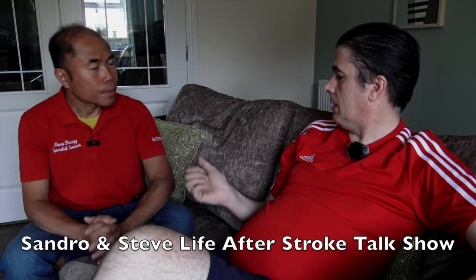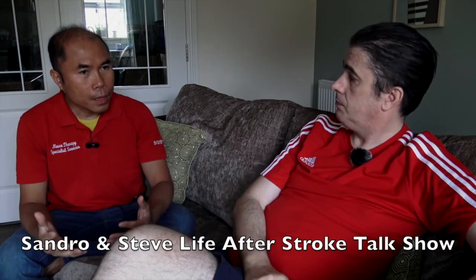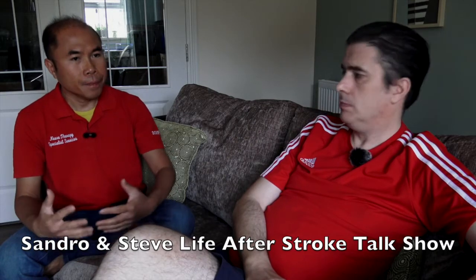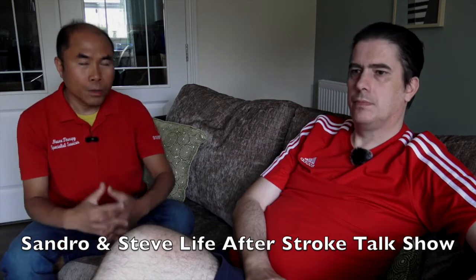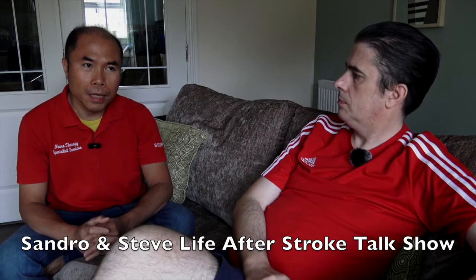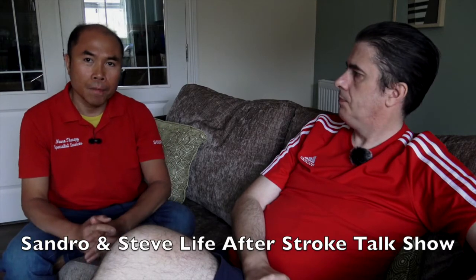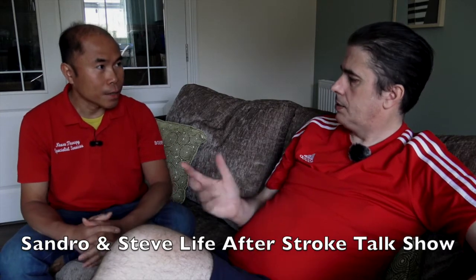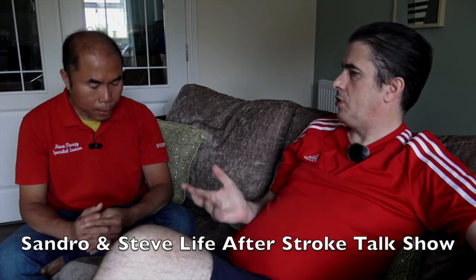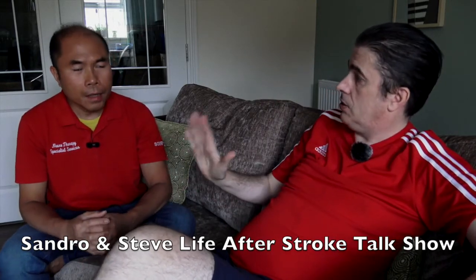So is that an exercise, Sandro, you have to do every hour, every 2 hours, or 2-3 times a day? It's a regime you will incorporate to the exercises you're already doing. So if you're doing, let's say, a morning exercise for the hand and the arm, you incorporate that. You use that as an adjunct, if you like. So can I put it on? Say if I want to watch TV at night time for an hour, can I put it on while watching TV? Do the exercises like that?